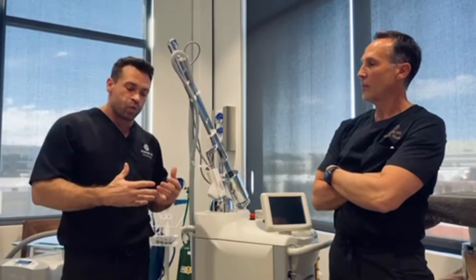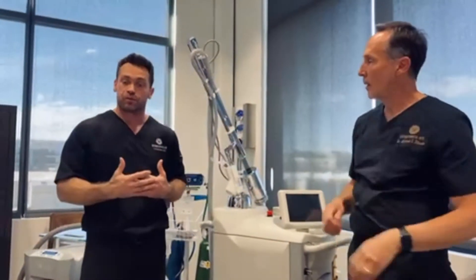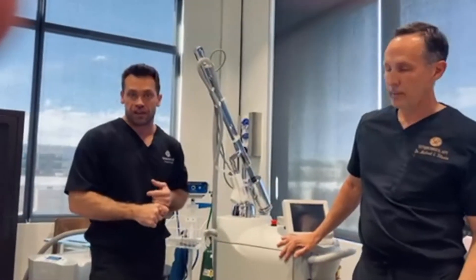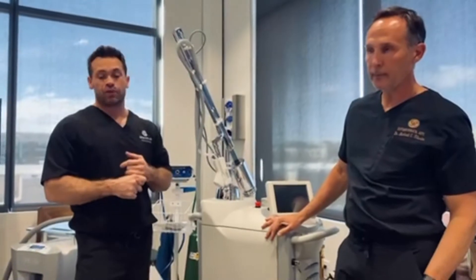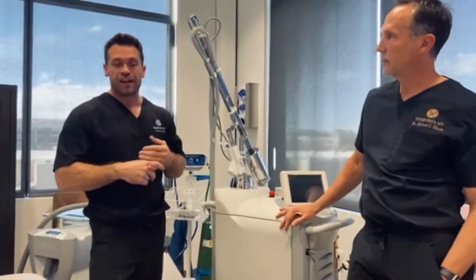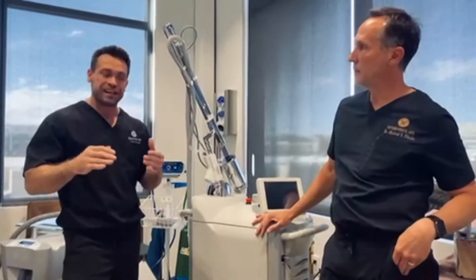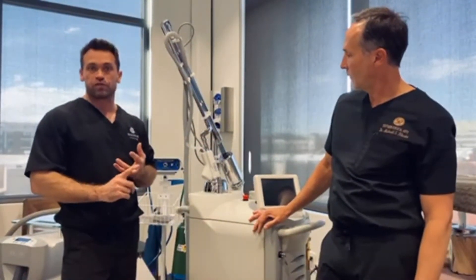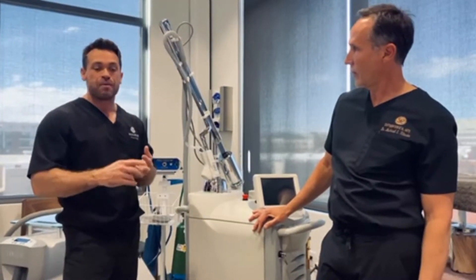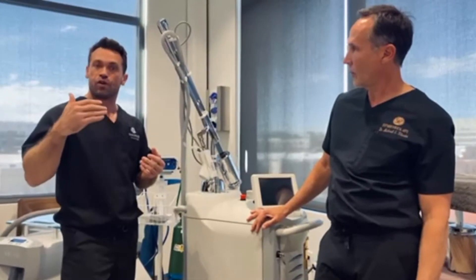We can get the results that CO2s and erbiums have delivered for years, but historically we had to deal with extraordinarily long downtimes, much higher risk of hyperpigmentation, and in terrible cases, hypopigmentation, scarring, and all the things that go along with it. Now, if you combine both wavelengths, you get the best of both worlds — very close to the same results, but in many cases the patient could have makeup on within a day or two or three.